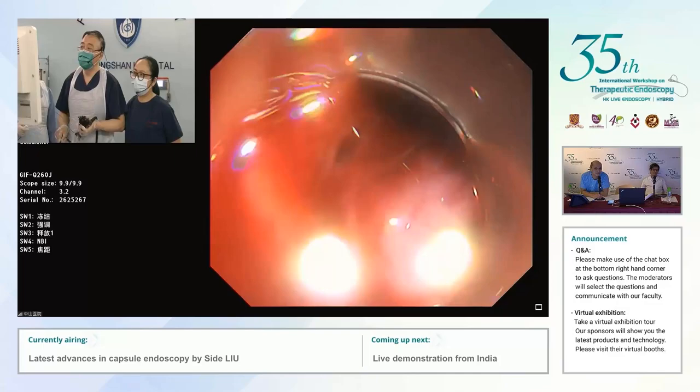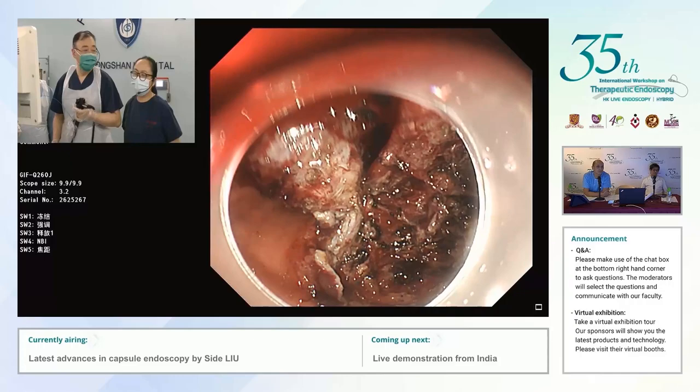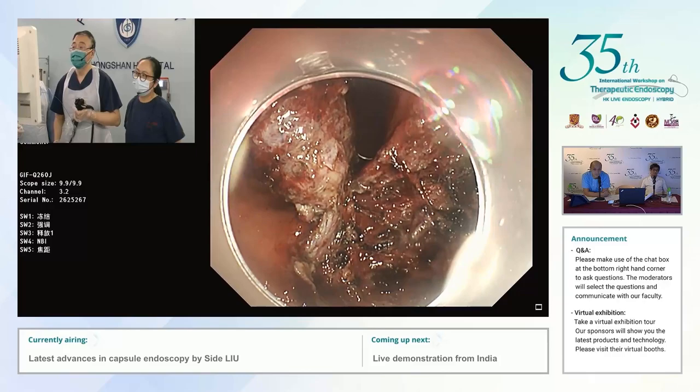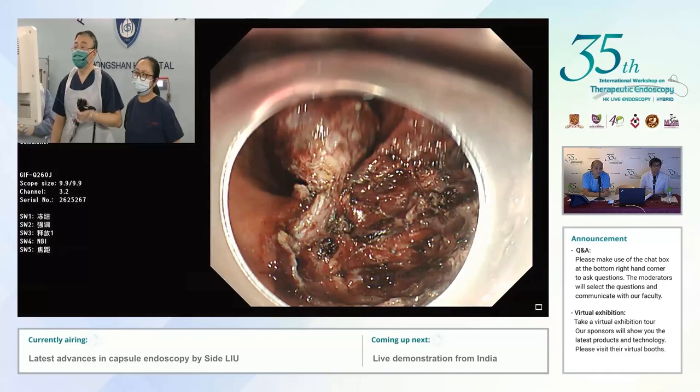This case is also very, very difficult and challenging. From CT scanning, you can see the lesion located at the posterior wall of the angle. The lesion was about four centimeters, and one half of the lesion was actually outside of the stomach.